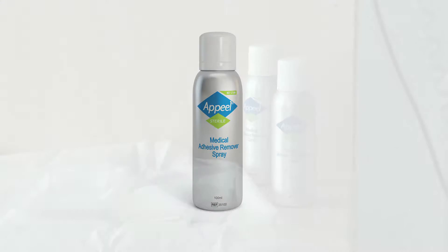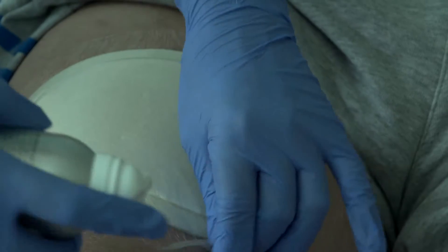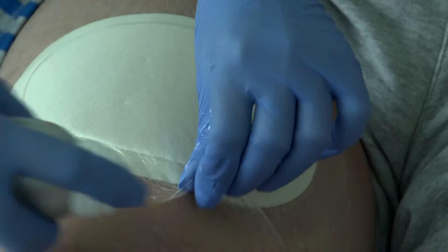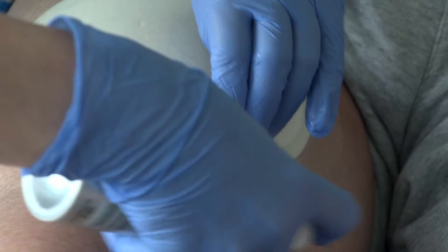Appeal Sterile Spray. Spray 10 to 15 centimetres from the skin. This can be applied at any angle, even upside down if required.